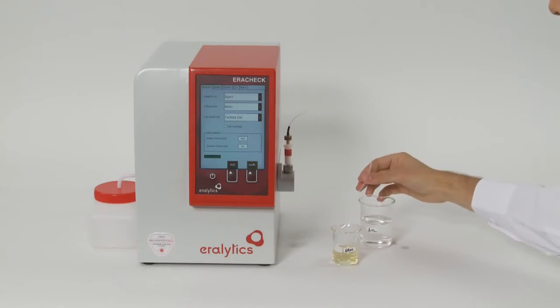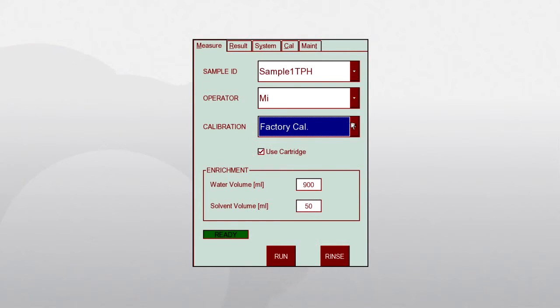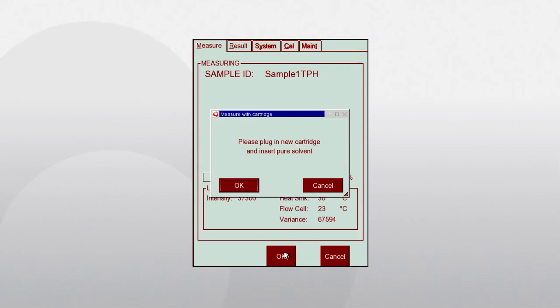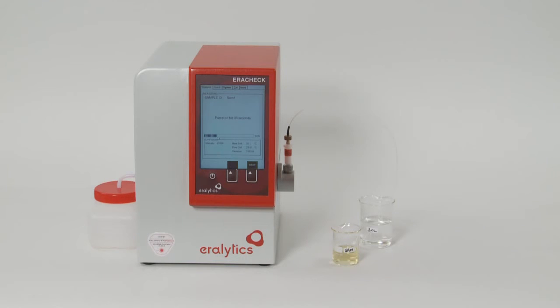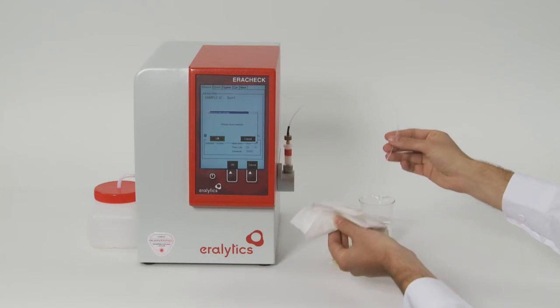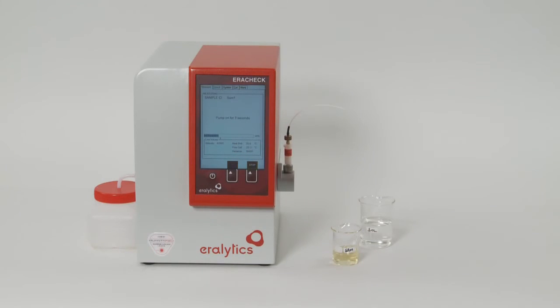On the display, select 'use cartridge' and the predefined calibration for ASTM D7678, then push run and follow the instructions of the automated measuring procedure. The analysis is finished within three minutes, and the displayed result is the concentration of total petroleum hydrocarbons in water, measured in milligrams per liter.